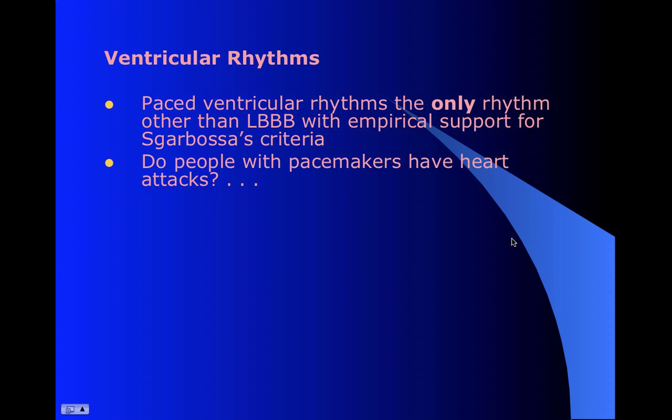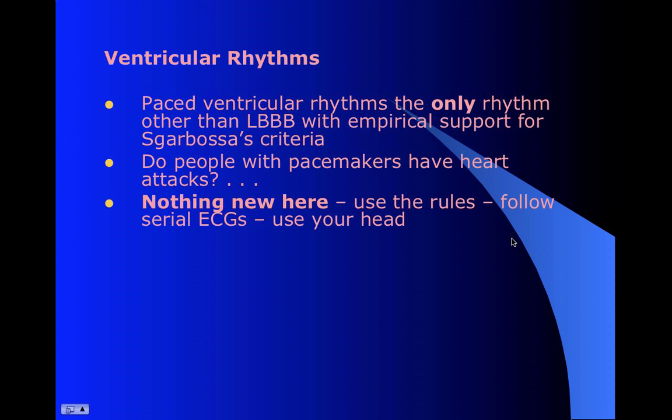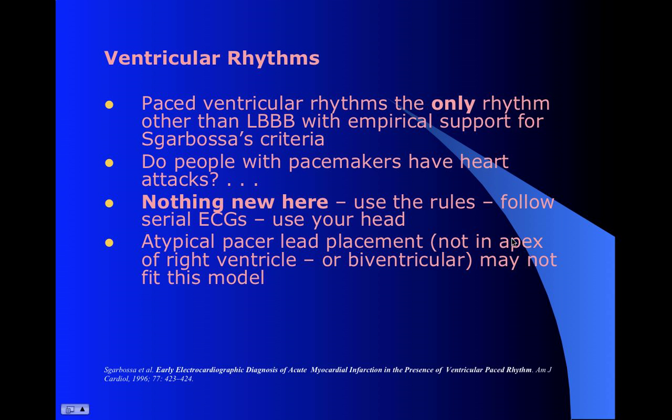I don't know how many times I've seen a medic say, well, he's got a pacemaker, we're not going to get anything out of that 12 lead anyway. But do people who have pacemakers have heart attacks? You bet. They've already demonstrated that they have problems with their heart. So we really want to be able to look past that and look for that potential STEMI. So again, usually the principles that we've already talked about, these can be tricky, but they are certainly workable.